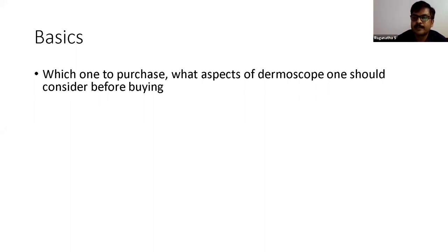Anybody else who wants to add to that? Yes, myself. Thank you, Enzo and Dr. Raghu. In India, we have the video dermoscope. Video dermoscopes are more used in India because of their magnification, and they have both polarized and non-polarized modes also. But what I personally feel is that video dermoscopy is better for hair analysis, hair-related diseases and scalp-related diseases, and handheld, that is hybrid, as told by Enzo, is better for skin analysis. This is my take.